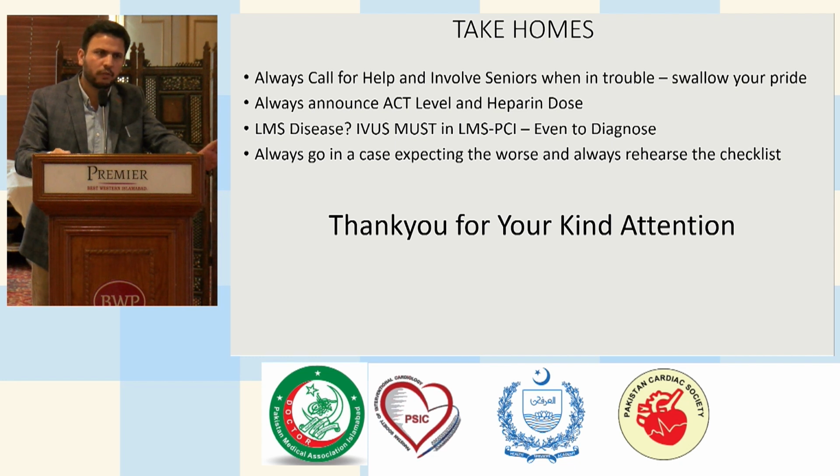Always call for help. Always involve your seniors. Swallow your pride. Always announce your ACT levels and heparin doses in the cath lab. With distal left main disease, IVUS is a must in left main PCI, even to diagnose. And always go into a case expecting the worst, and always rehearse your checklist. I thank you for your attention.